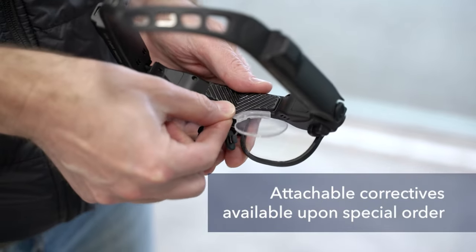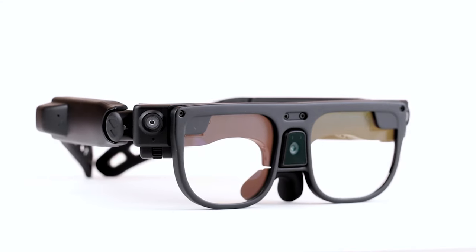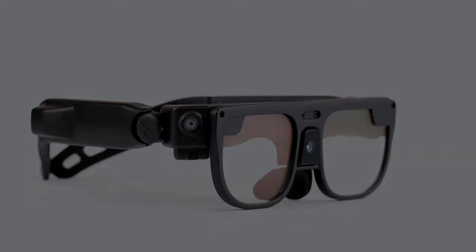Prescription attachments are available as an alternative to wearing Argo over your own glasses. And that's how you can get Argo adjusted to fit you as best as possible.